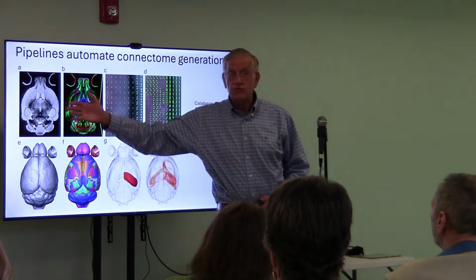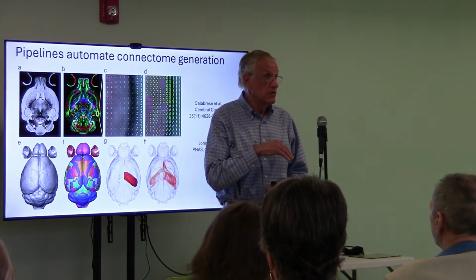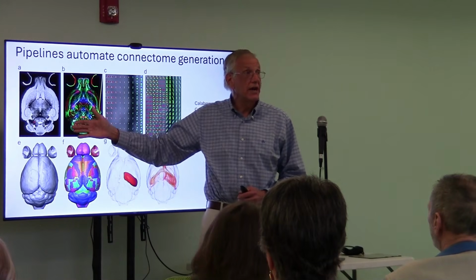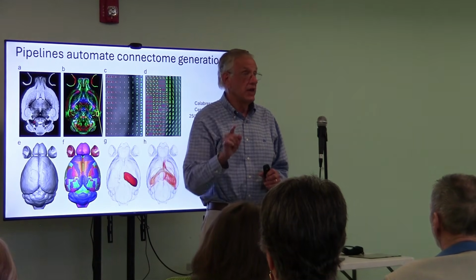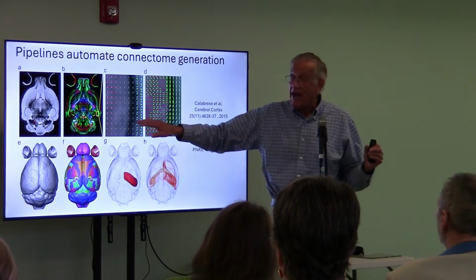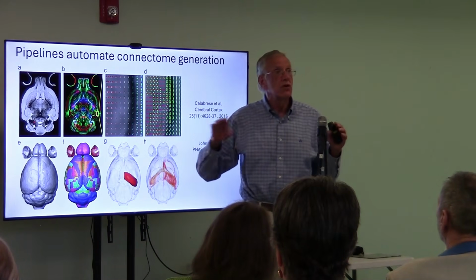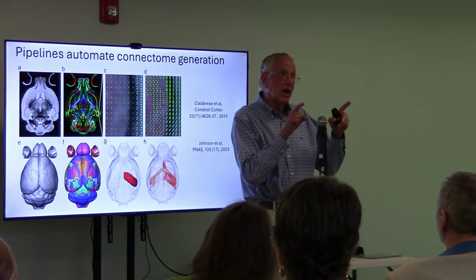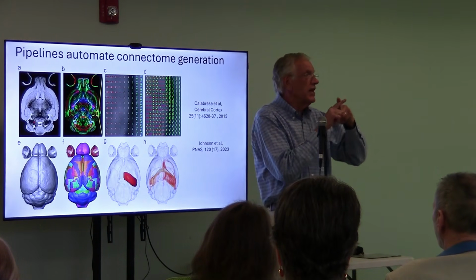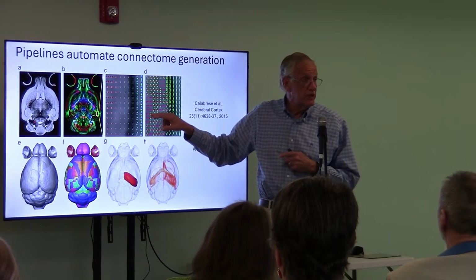This is a single slice from one of the representative images. This was a 10-day scan. We now do them in 22 hours, but this was 2015. Single slice. This is the calculated color index image where we know what's going forward, what's going left, what's going right. And from the math that I'm not going to bore you with, I couldn't reproduce it, you can go in with enough measurements and you can say, all right, I might have two types of fibers in that. Let me unwind them.